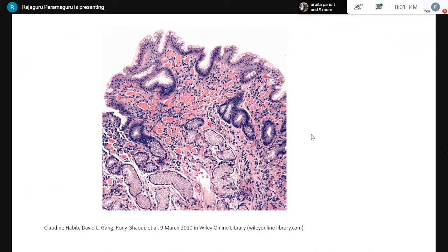So this is a special form of gastritis called Russell body gastritis. In this particular image, the immunoglobulins are very big and quite fiery looking, but they are usually not this bad. Just keep in mind that you should not confuse the Russell bodies for signet ring cell carcinoma. If in doubt, you can perform an IHC. This has no clinical significance, it is just a pathological entity, nothing else. Just keep in mind and do not confuse it with signet ring cell carcinoma.